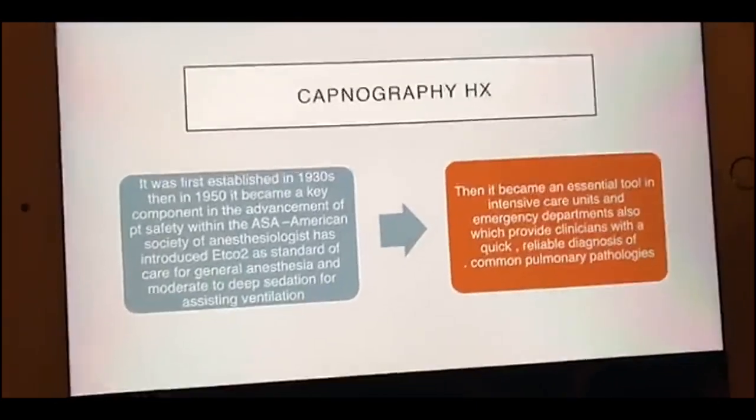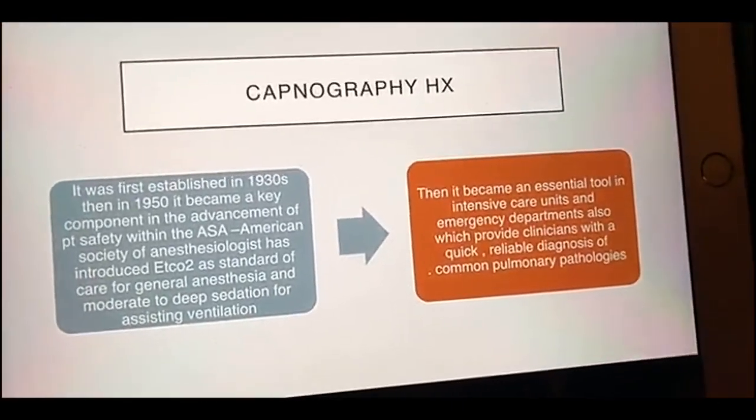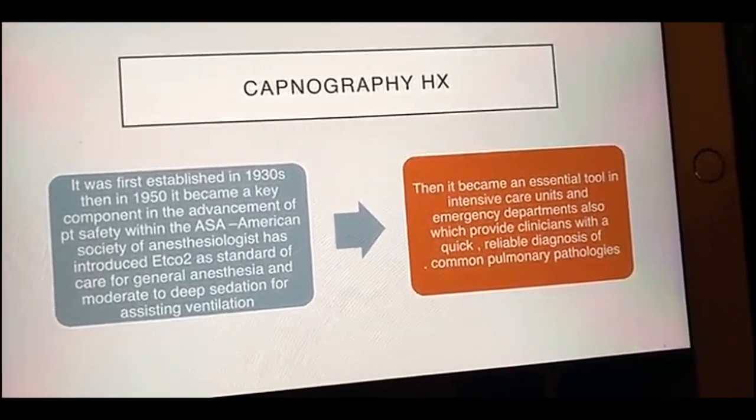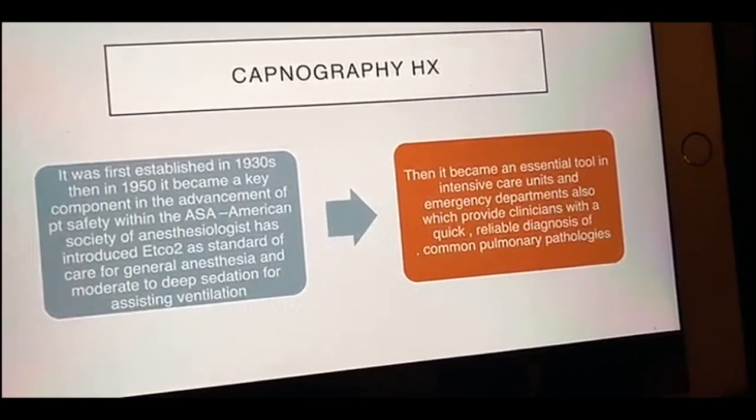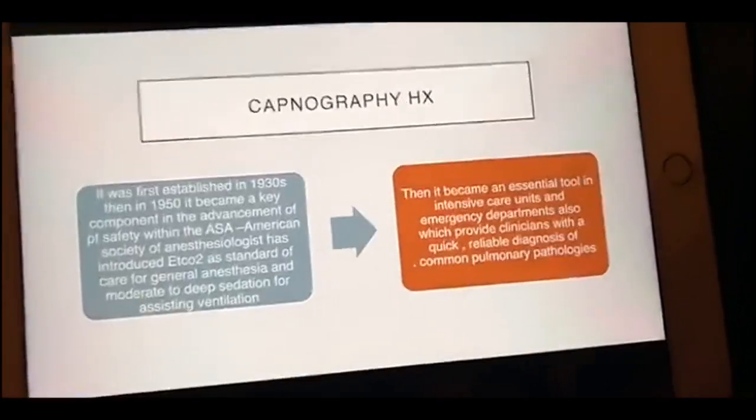Then the use of capnography spread and it became an essential tool in the intensive care units and emergency departments. Also, it provides the clinician with a quick, reliable diagnosis of common pulmonary pathologies.